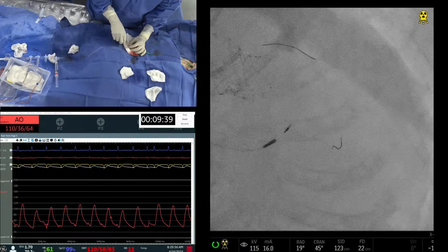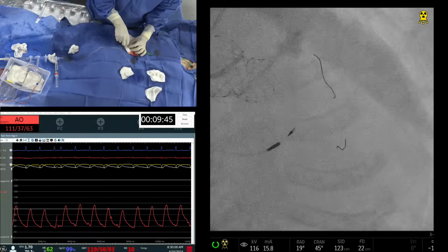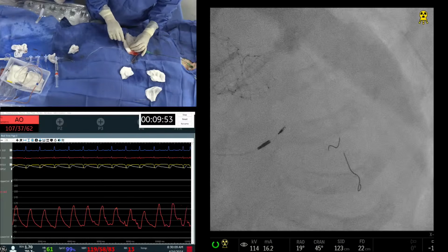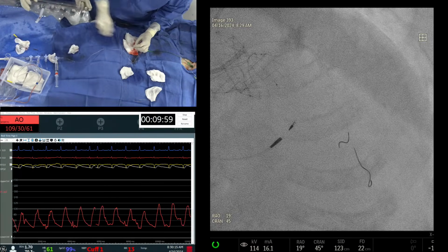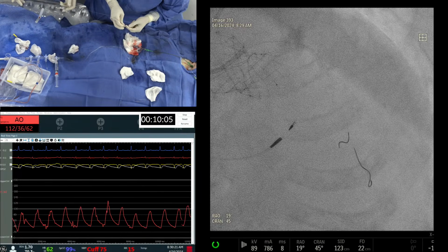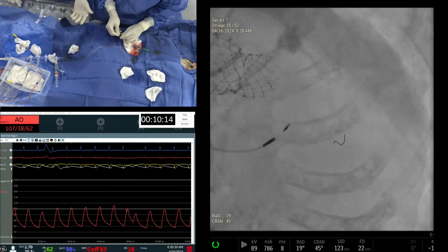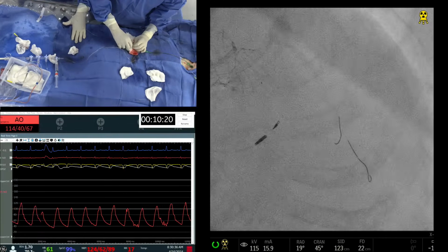And this is where many people, like you mentioned, when the RCA is totally occluded and you're working on the LAD during rotablation, put in a pacemaker just for this, because it can really cause trouble. We have seen some cases like that. Yes, you have to be cognizant about it. But if you have not created slow flow in the LAD, then it is unlikely to affect the collaterals of the RCA. If the LAD starts having slow flow, then you will definitely have trouble in the RCA also. Like this case here, there is nice flow, no slow flow. But if you start having slow flow in the LAD, the collaterals will be badly affected. So, Samin, we welcome.